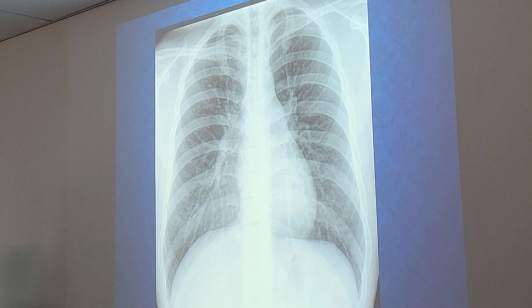But as a general rule of thumb, how do we know that chest x-rays are done? They're generally done PA. So if you don't see mobile or portable, you can assume that it's PA. Another way to tell if it's PA, we went over this last week. The heart, stomach presence, liver presence. No, I'm asking you, how can you tell if it's AP or PA? Oh, the clavicle, the shape of the ribs. Shape of the ribs. Mr. Frank, do you want to explain that? Because I don't like looking at the ribs because it confuses me.